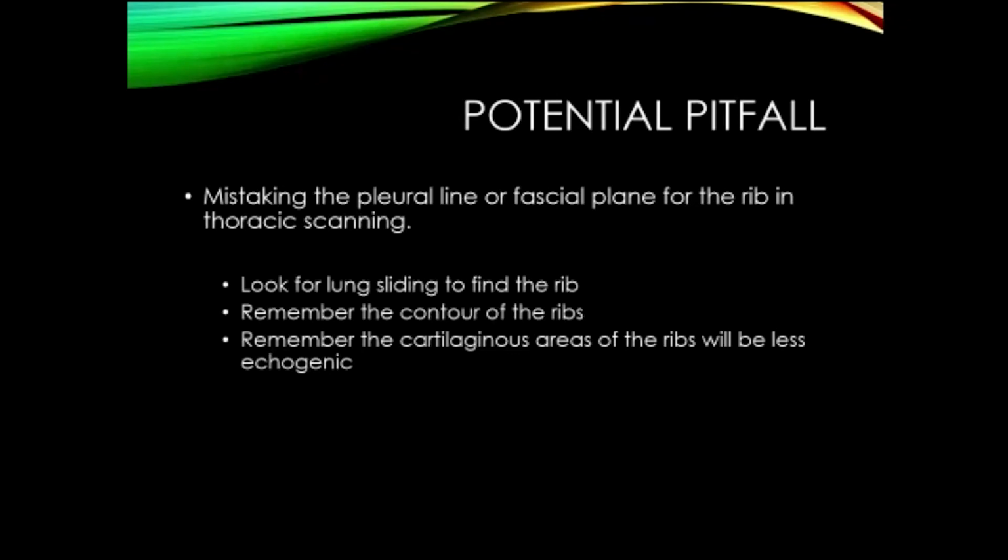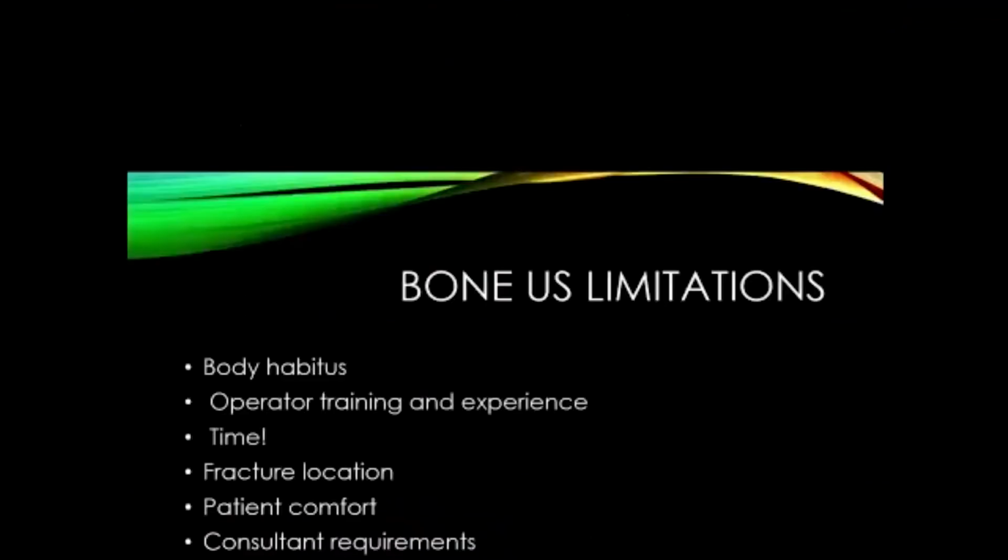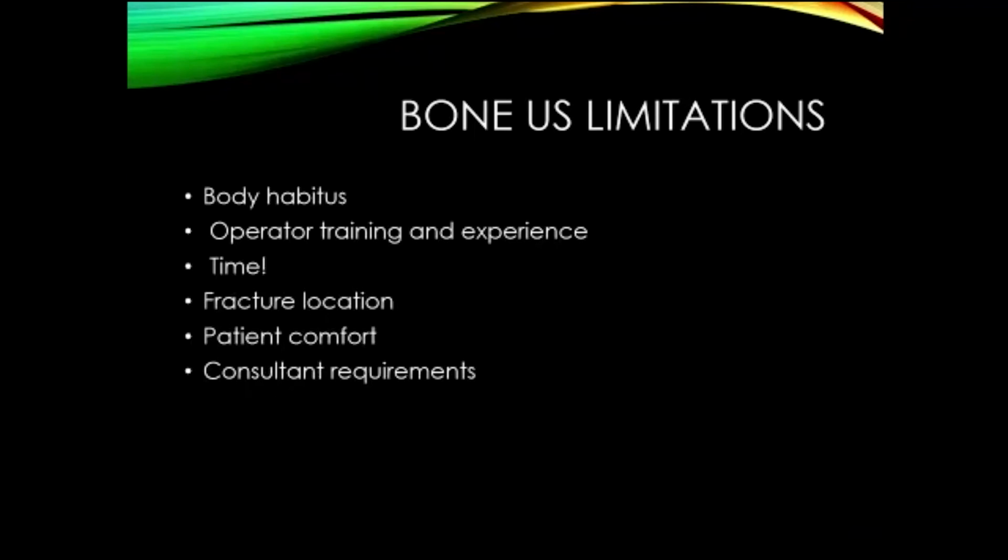And of course, if you have a pneumothorax, there won't be lung sliding, but there will be another bright white line below the rib. And if it's in the bony portion, you'll have that gap where the rib is shadowing. And remember the contour of the ribs, they're curved, and that the cartilaginous areas of the ribs will be less echogenic.